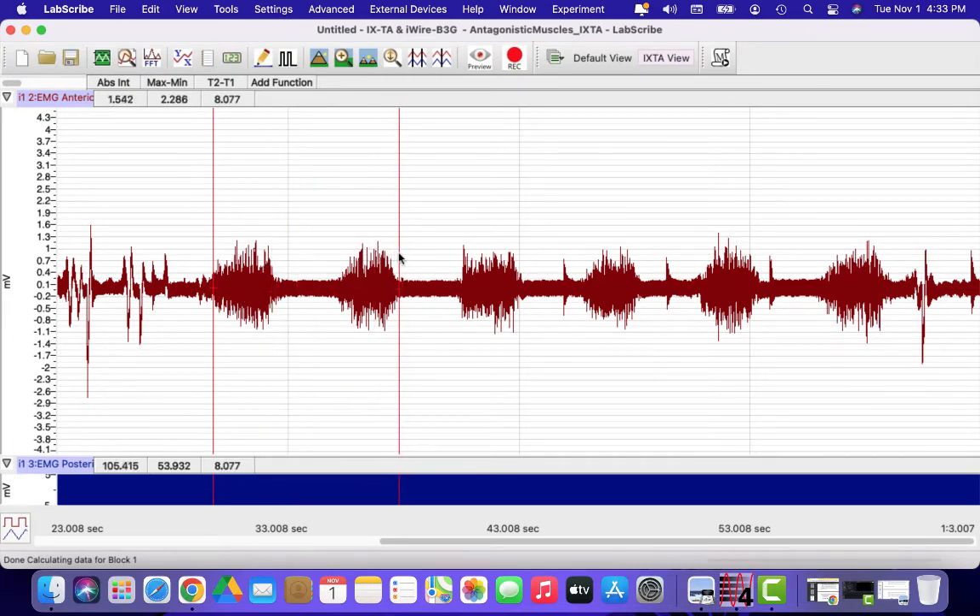I'm going to scroll down and measure the next burst. I move my cursors again to the beginning and end of the burst and look under the heading of absolute integral — there's my data. The absolute integral number is the number you want to record and keep track of in order to compare.